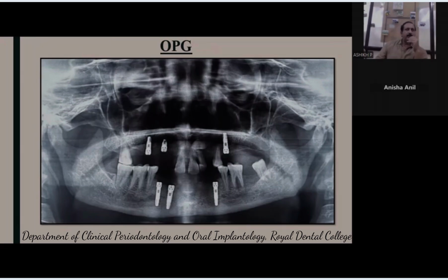So you can plan an implant in a very comfortable manner here, because your socket is possibly diverging towards its base in the distal area. That is also a good sign. So you have a very tent-like bone here in the area where you're planning the implant. So 2 millimeters away from the nearby tooth.